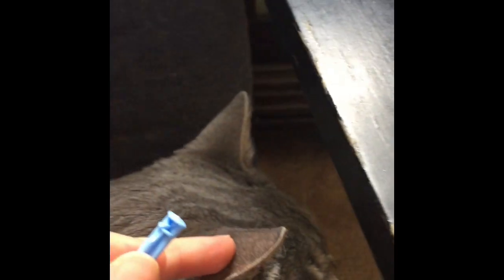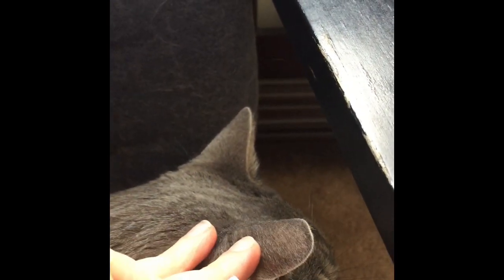On the outer edge of the ear, kind of just right along the outside edge right here. If your cat's ear starts getting sore after a while, you can do it in here and you can poke from the inside or the outside. I generally find it easier to go from the outside, but once in a while I'll do it from the inside — it's fine. Some people are scared to not use the device because they think they're going to poke all the way through. I've poked through my cat's ear so many times and she doesn't even flinch, so it's really not a big deal.